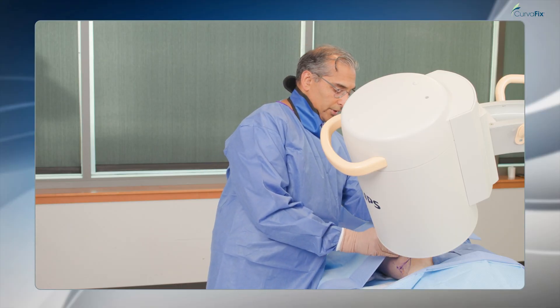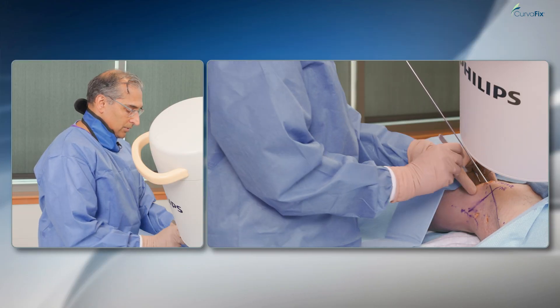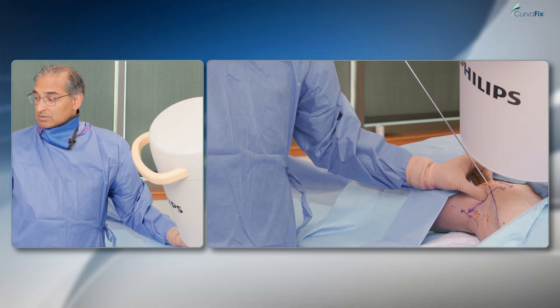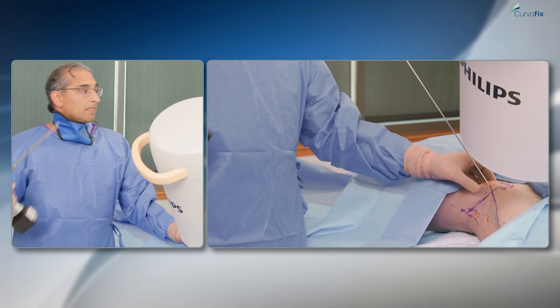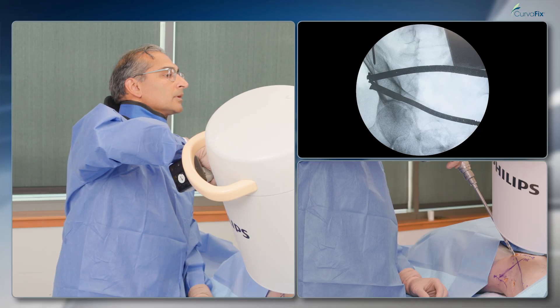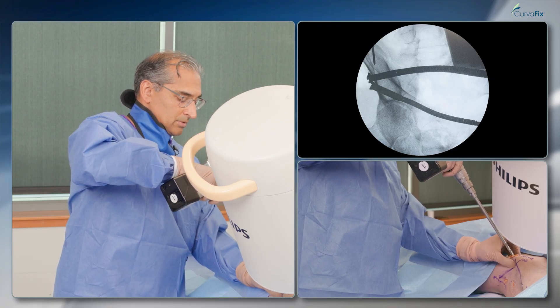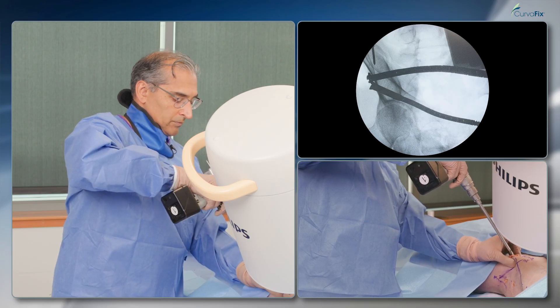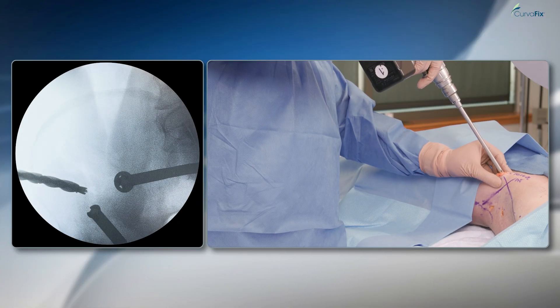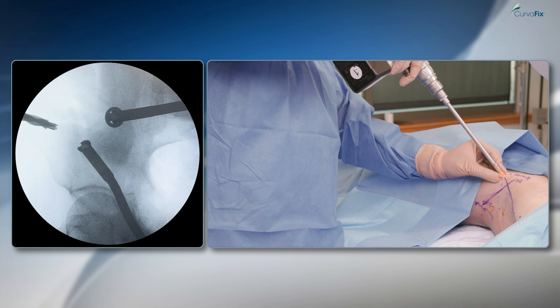Because this entry point is relatively superficial, the need to use the triple sleeve is less necessary. In this case I'll just use an opening reamer and then place my tube for my ball tip guide wire. I'm navigating between the inner and outer tables. On checking the other view, I can see I'm going way too posterior, so I'm going to correct that to head more anterior — and we can confirm that correction on imaging.